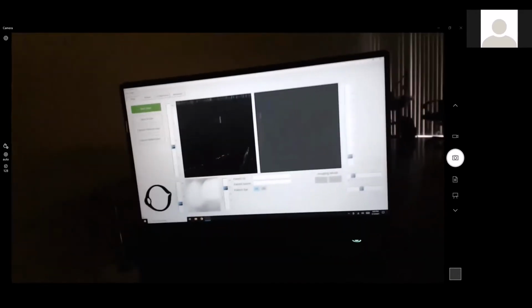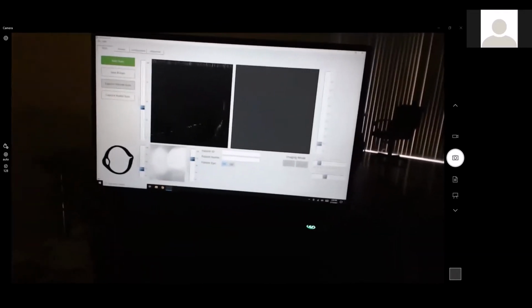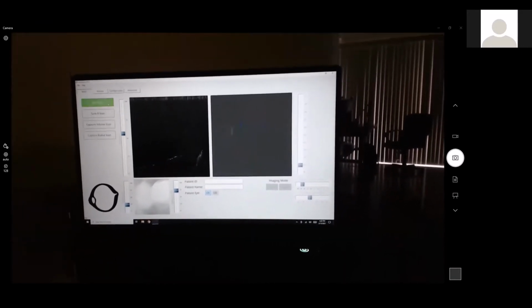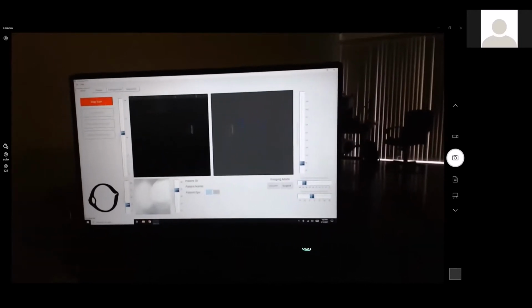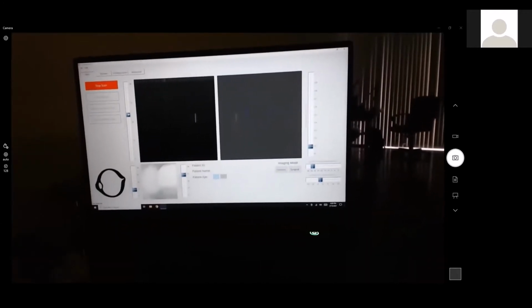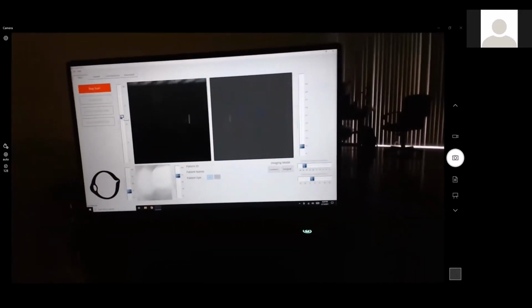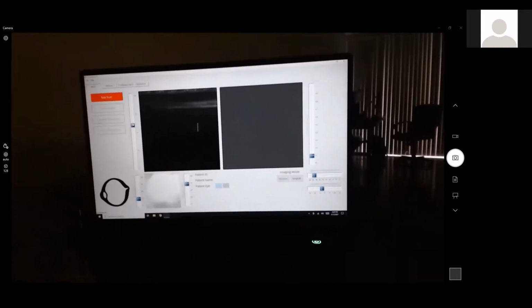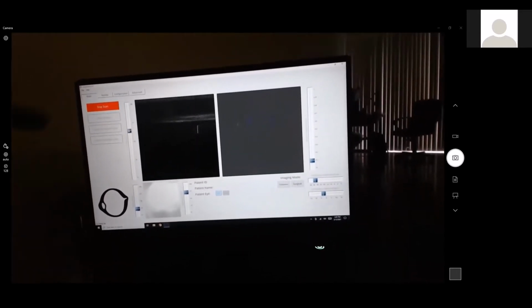You want to do that, Sean, before we're into the retina side? So for our system, we would use the same optic, but we make one change where we will actually change our focal value, so it's focused on the retina. So Sean's going to turn on the focal value, change the values. In this circumstance, our focal value for cornea, it may not be relevant to you guys, is 40.1, but we're going to change our focal value to 61.1, and that then gets the retina in a better focus. And you can already see it's coming in.